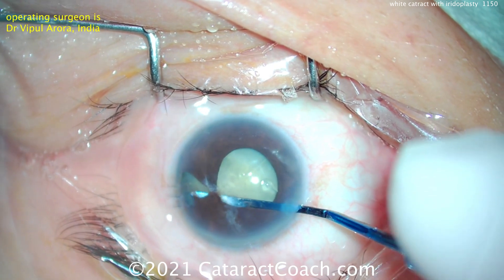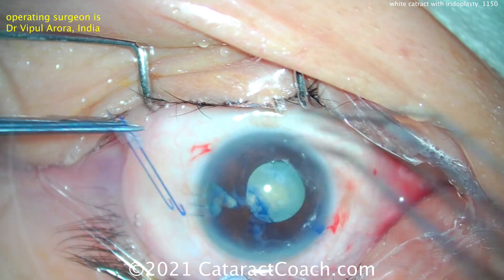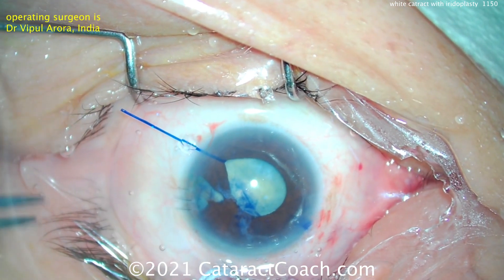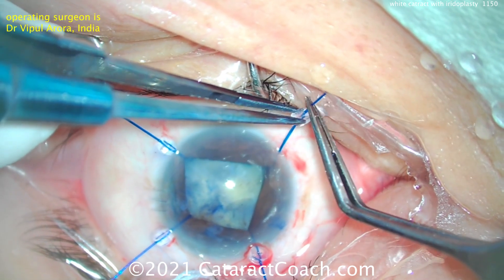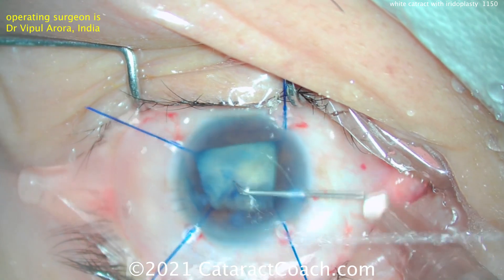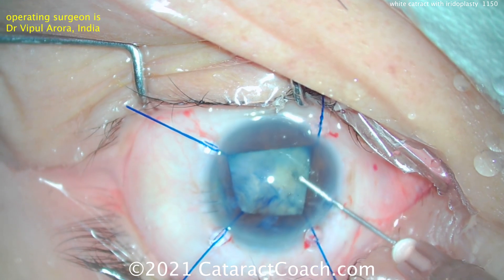He's trying to see if there's any kind of mobility there on the iris. Let's put some iris hooks in. You can see the capsule has been stained with TriPan Blue dye. And the lens capsule was open, so the whole lens became opacified — that was with the previous surgeon. Now a system can be used to really finish up that capsule opening and make a proper capsulorhexis.